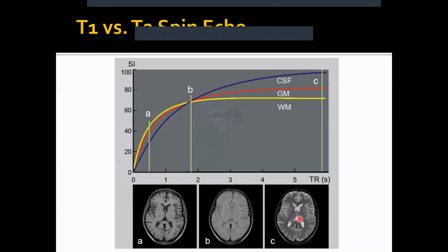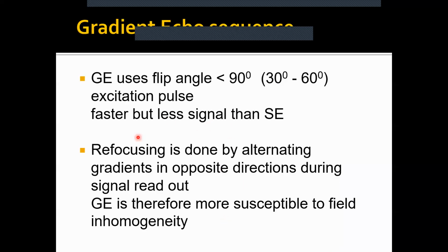This here, letter C, is your T2 weighted image. Again, because fluids take a lot longer to relax, in the later phases you're going to see the fluid light up a lot more brightly. Number B, you don't really have to worry about. She mentioned in the lecture that it's not important for this image.